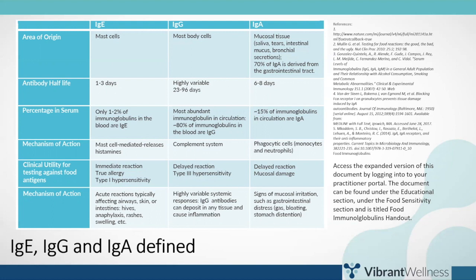On this page, you'll also see IgE indicated, which is specific to an allergy. It is not a sensitivity. IgG and IgA are the antibodies that we look at for sensitivities. IgA antibodies are produced by the intestinal mucosa as a defense mechanism. If IgA antibodies are elevated to a particular antigen, this can indicate an immune response to mucosal irritation or damage.